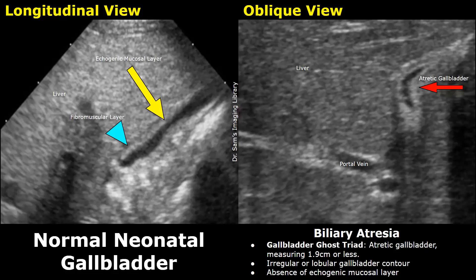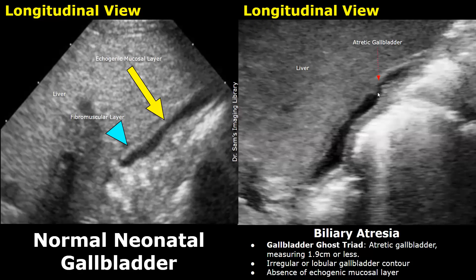In the ghost triad, we can see a small gallbladder with irregular or lobular contour and absence of a distinct echogenic mucosal layer. This gallbladder measures less than 1.9 centimeters. In some cases, the gallbladder is too small to be seen on ultrasound.